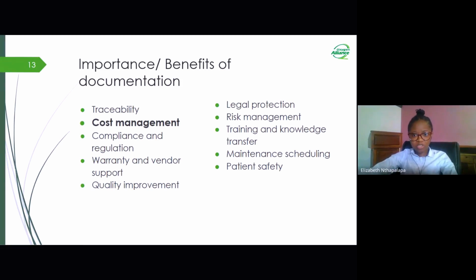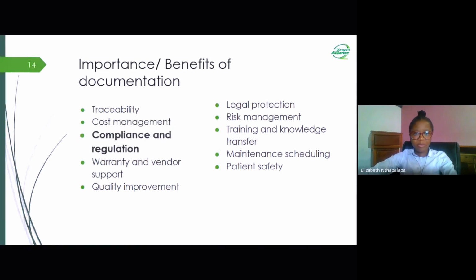And moving forward, we also have cost management as one of the benefits that we get out of documentation. If we have effective documentation, it allows healthcare facilities to budget for equipment, maintenance, replacement, and upgrades more accurately. This is helpful as it also allows health facilities to do cost control and better, more reasonable resource allocation. The other importance of documentation is compliance and regulations. Since healthcare facilities must adhere to strict regulations and standards, proper documentation ensures that equipment maintenance and handling meet these requirements.